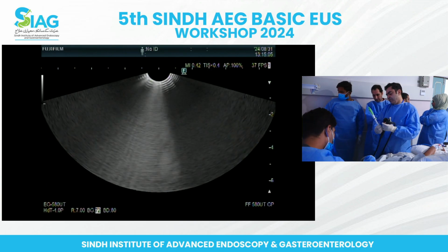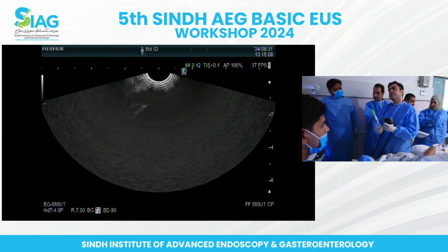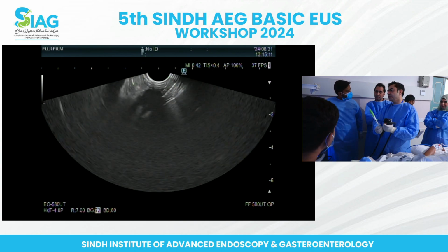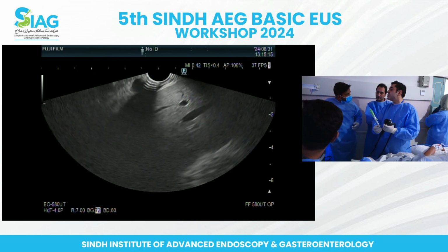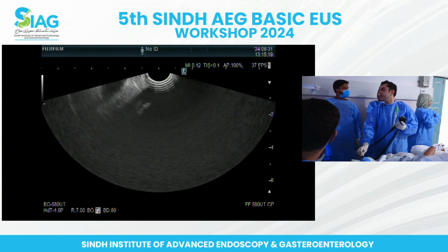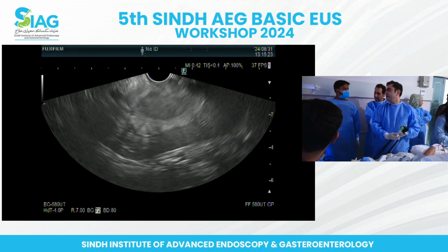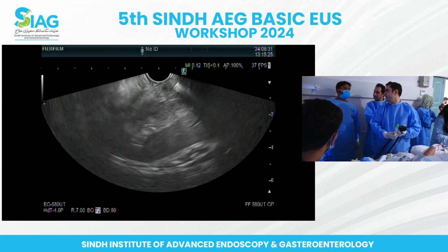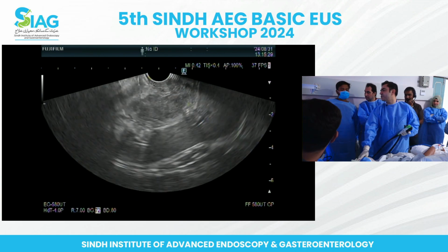So when I do the biopsy, I just try to push this forward to see whether the needle is out or not, so that you are not damaging the scope, and then you can pull it back. Why do you want to pull it back? Because otherwise it's too far out. When I am at this lesion, if it's too far out, it won't be very effective for me to do the biopsy. So I want it close to the scope, but not inside.